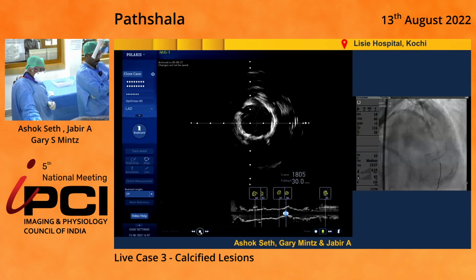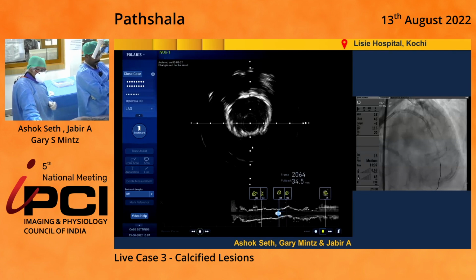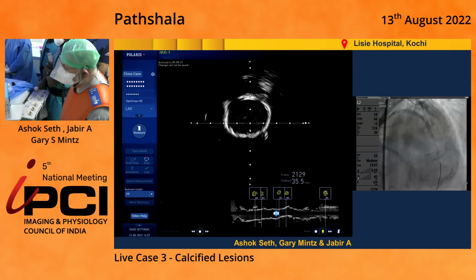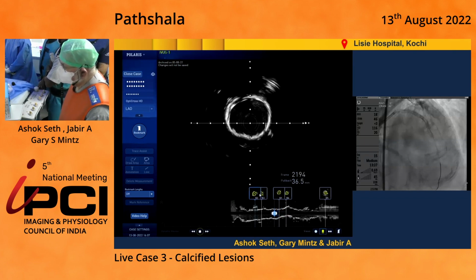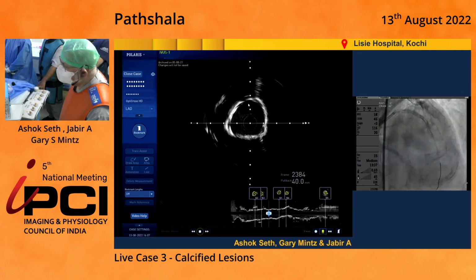A couple of skip areas where it's about 4 square millimeters there and here. And you can see the amount of calcium. This is totally socked in with circumferential calcium. This is probably the point of overlap, part of the point of overlap of the two stents. At this point, the stent actually plumps up to about almost 8 square millimeters.